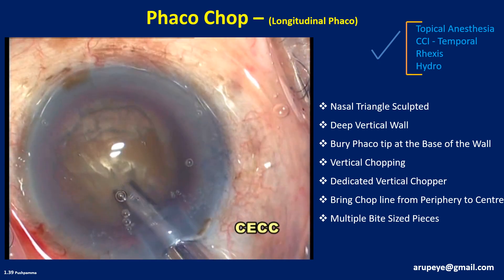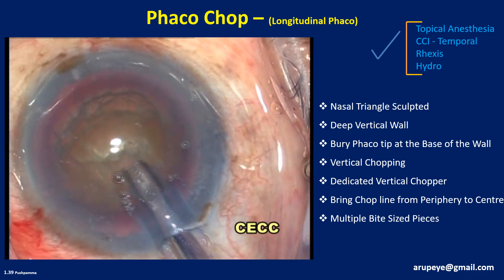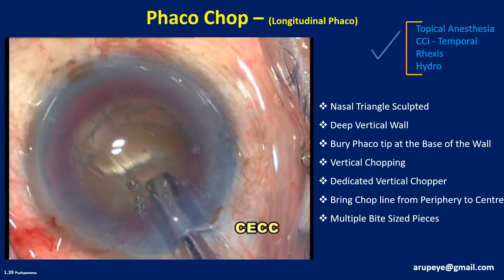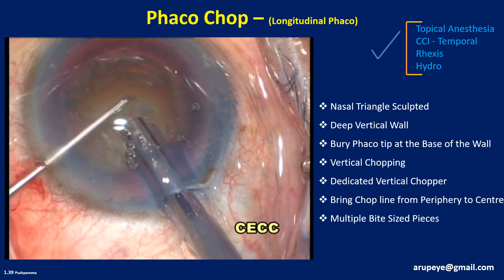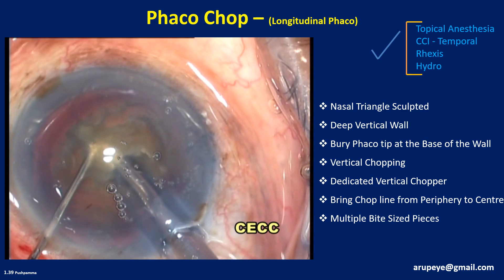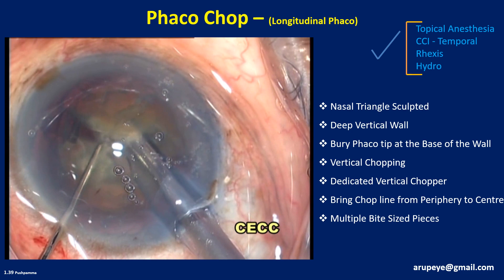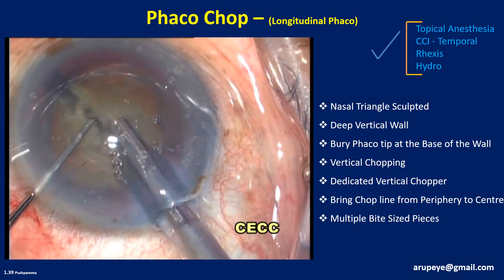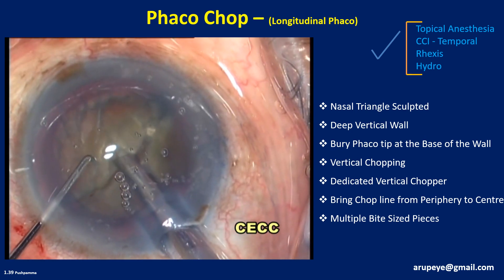In this typical case, a triangle with its apex towards the incision is sculpted, ensuring a deep central wall. The phaco tip is then buried into the nucleus employing high vacuum settings, through the deepest aspect of the wall, and chopping is begun. The phaco tip is kept stationary, and the chopper is manipulated appropriately to generate a full thickness peripheral cleavage line. The developing chop line is gradually extended centrally by employing step-by-step chop in situ.